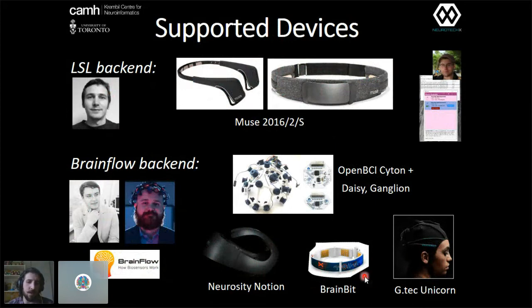And actually the list goes on. So really now there's a very exciting new phase where we're becoming a kind of universal mobile EEG cognitive neuroscience platform, mainly thanks to the functionality that's coming through BrainFlow. This is very early days on this, I should say. We haven't done very much testing with any of these, but we know that we can connect, we know we can get signal, and we're definitely looking for people to chip in and try things out and help us get some pilot data and see what we can do.